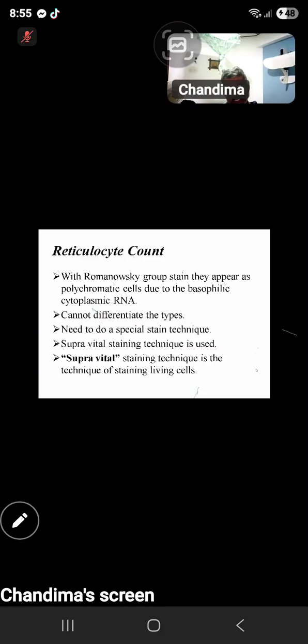I can't remember which one is type 1 and which is type 4, but according to the distribution of the RNA, from lesser to higher grade, we can differentiate type 1, type 2, type 3, and type 4. It is done with modern machines, right?